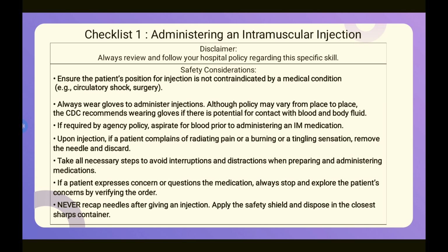Take all necessary steps to avoid interruption and distraction when preparing and administering the medication. If a patient expresses concern or questions during the procedure, always stop and explore the patient's concerns by verifying the order. Never recap the needle after giving an injection. Apply the safety shield and dispose of it in the closest sharps container.